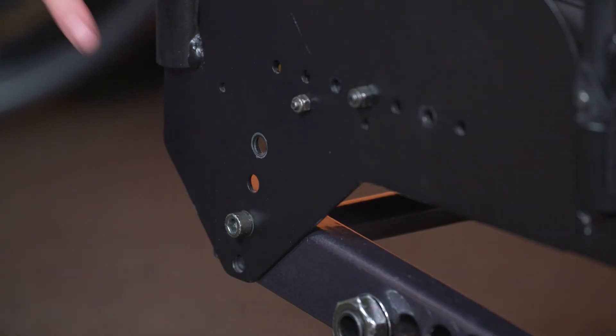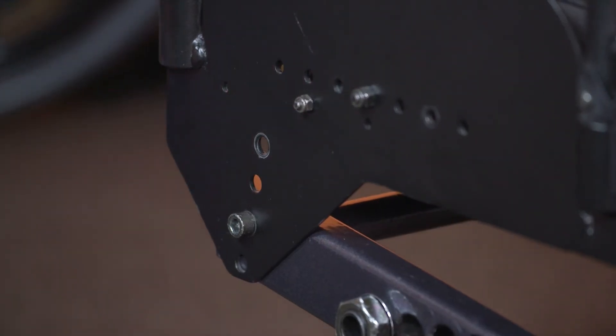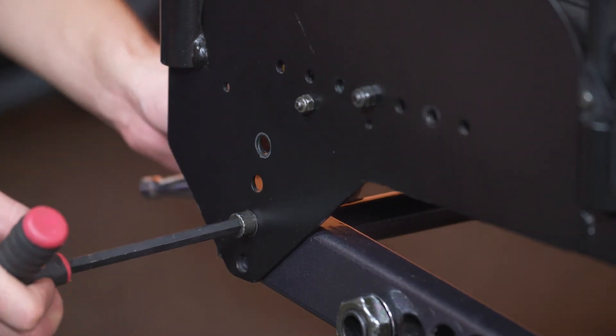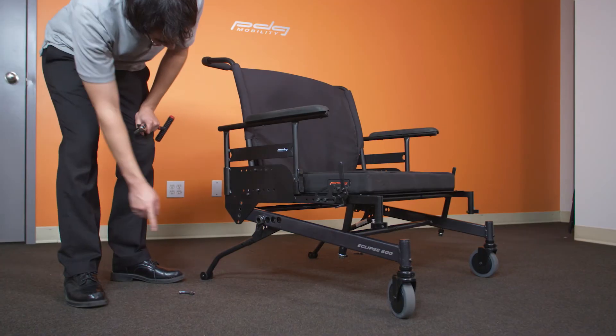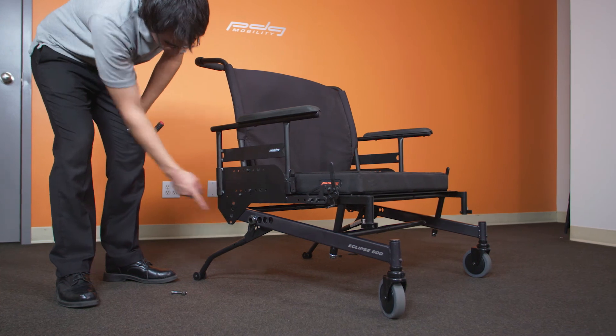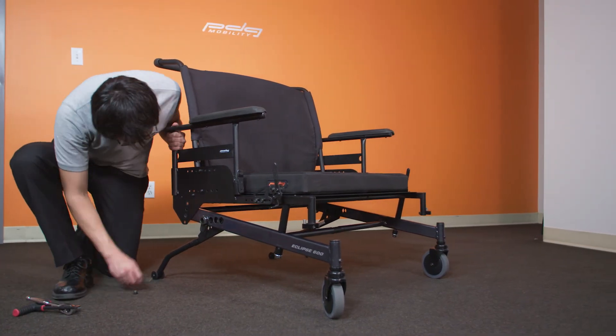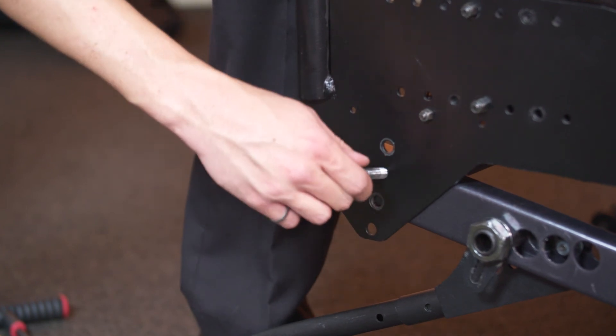The rear seat to floor height can be varied by changing the wheel size and by moving the bolts at the rear of the chair. With the front seat to floor height set, remove the screws at the rear of the chair and pivot the upper frame to the desired rear seat to floor height. With the holes lined up in the desired configuration, reinstall the screws and torque to specification.